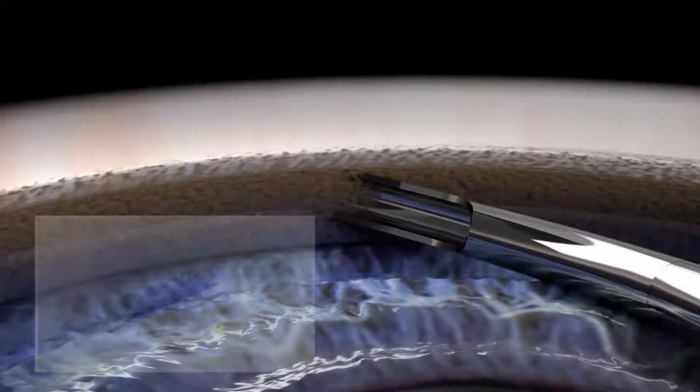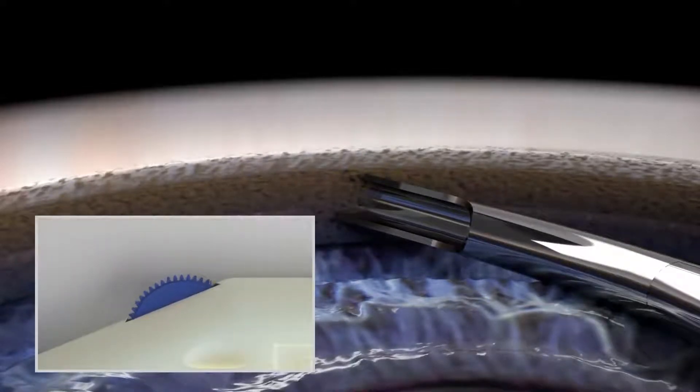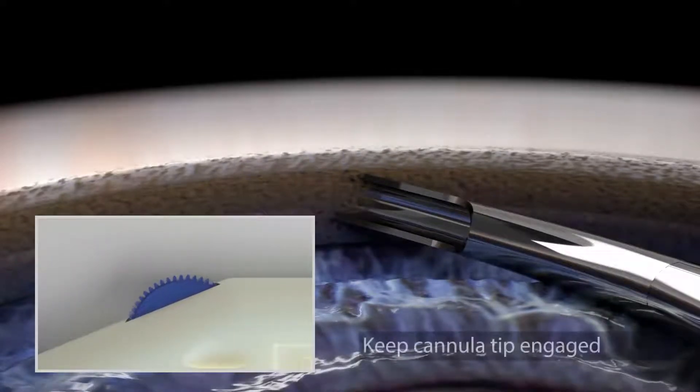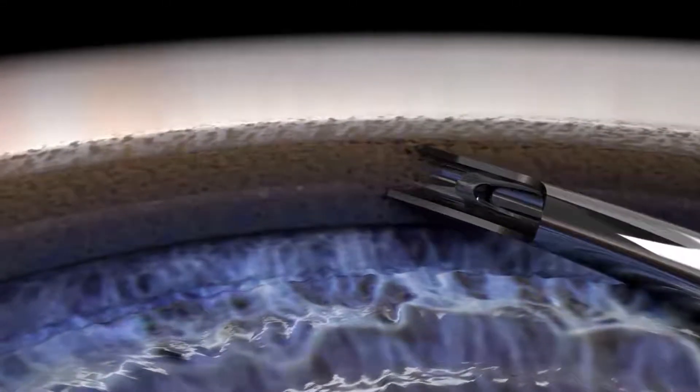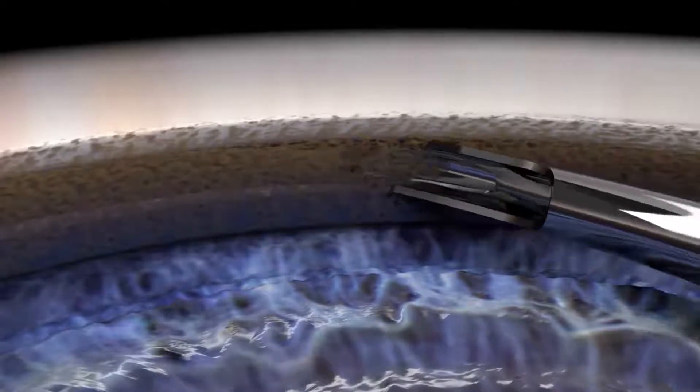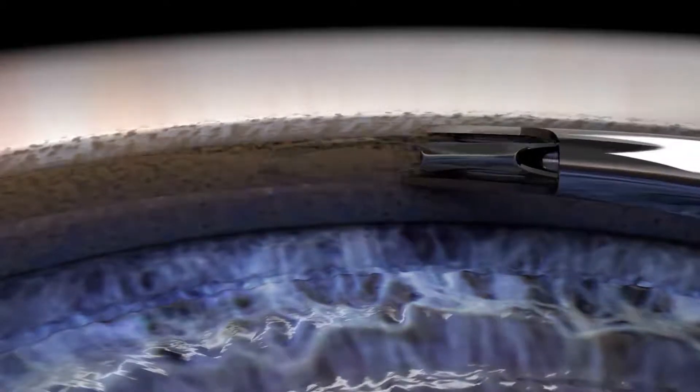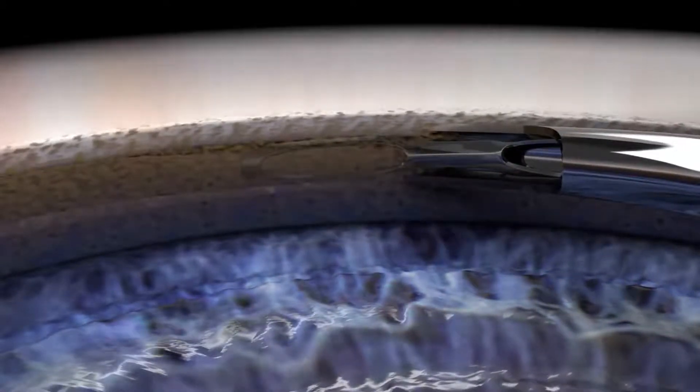Begin to deliver the Hydrus by gently rolling the tracking wheel forward while keeping the cannula tip engaged. Continue to advance the Hydrus with a slow and steady motion while gently relaxing the upward and forward pressure on the cannula.